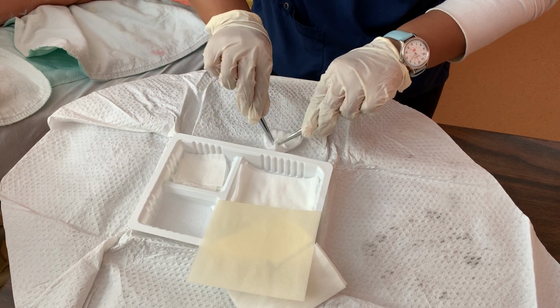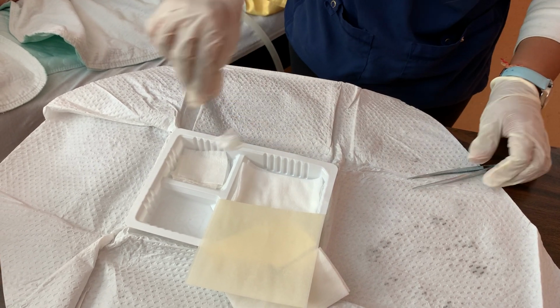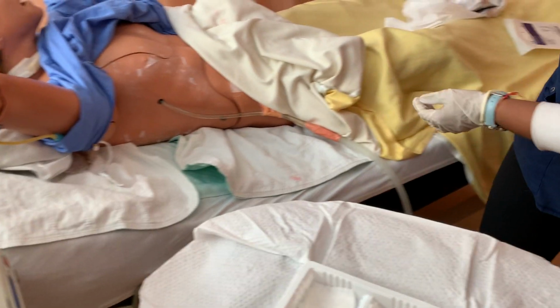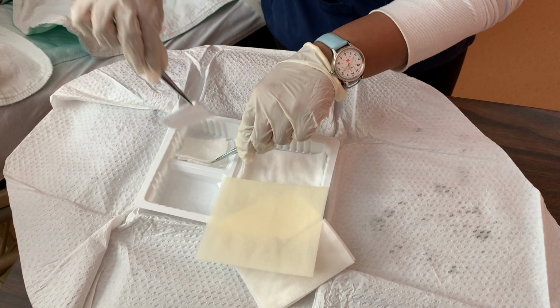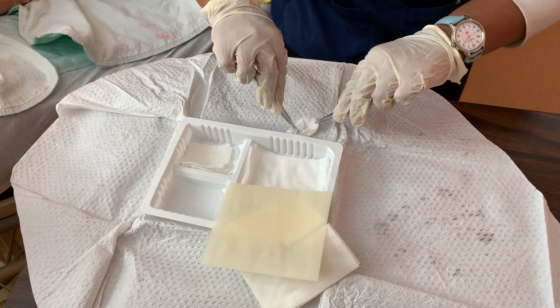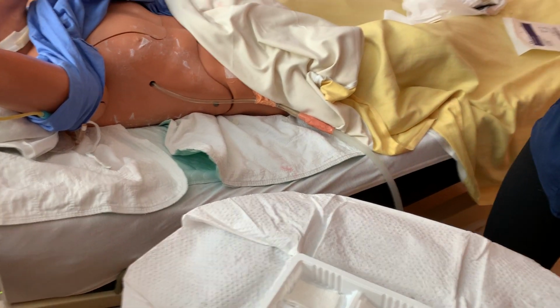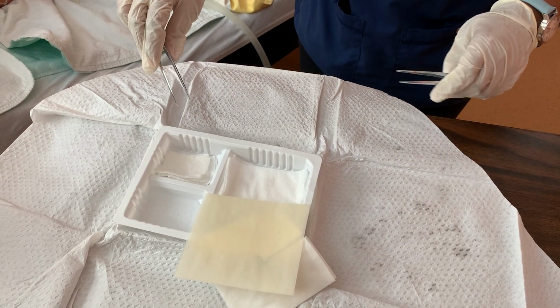I'm going to also clean the tube just in case anything touches it while we put the dressing on. So I'm just going to very carefully lift, clean the bottom of the tube, making sure my forceps are not touching the tube or the patient. Dip it in here, clean the top as well. So I've cleaned it and I've assessed it.